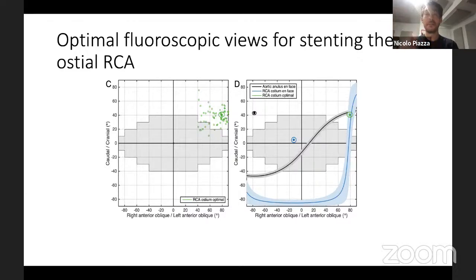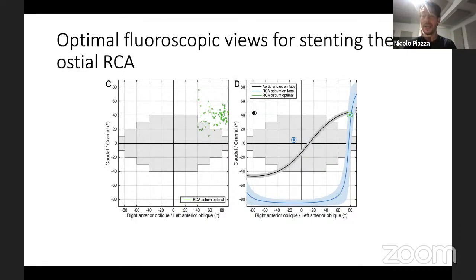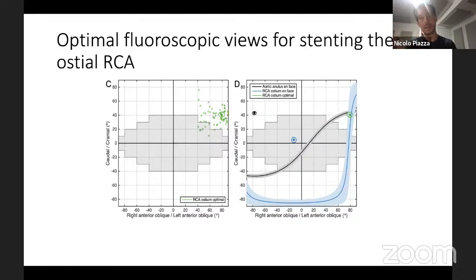Although we cannot achieve the perfect view, at least try to optimize things. I never stent an ostial RCA in RAO caudal — that view is for the proximal RCA, not the ostium. In LAO caudal you start to get the short axis view of the tricuspid valve, which opens up the body of the RCA but is horrible for the ostium. What I do when stenting the right: I go LAO 70, cranial 20 — sometimes LAO 80 or 90, cranial 5 to 10 — whatever I can get. I position and inject on that view. Once I've got it, I deploy my stent, then move back to something more comfortable. This is how the right coronary can look when you get the perfect view — LAO 85, cranial 37. Ask yourself: when was the last time you evaluated an ostial right in LAO 85, cranial 37?